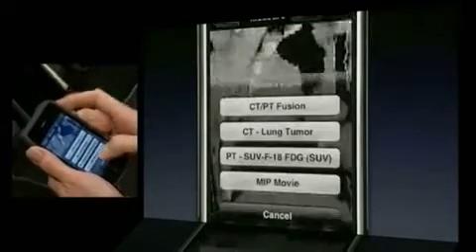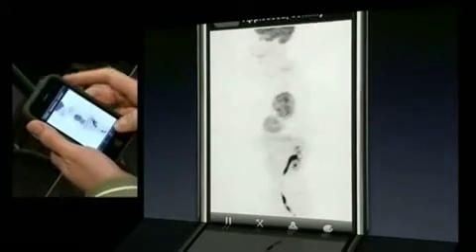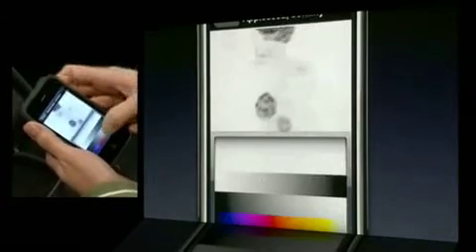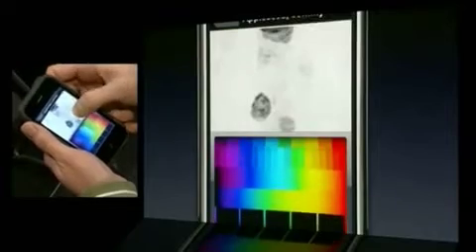Finally, let's look at the MIP movie. This is a 3D reconstruction ideal for visualizing PET images. Let's change the color for this — let's choose rainbow.